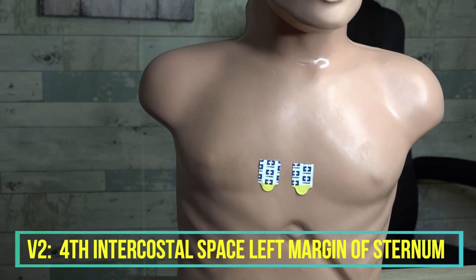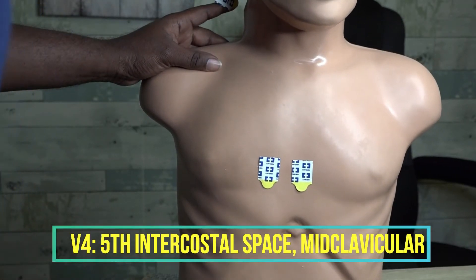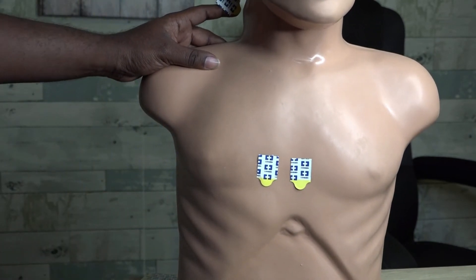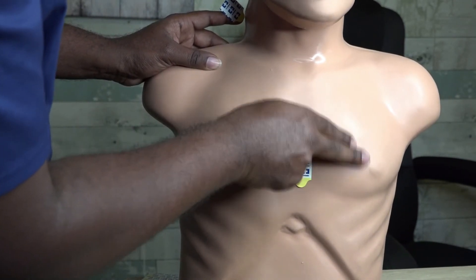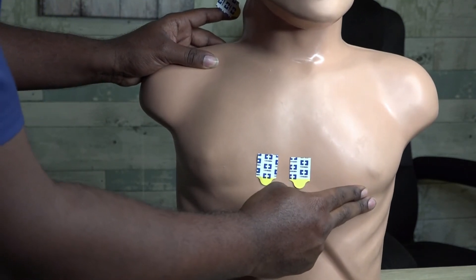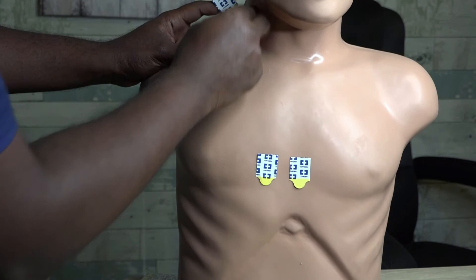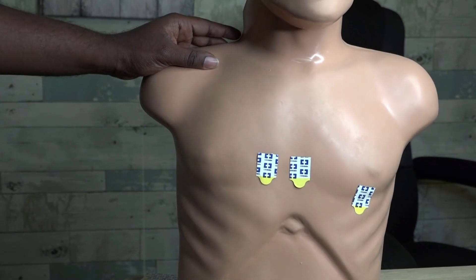Now I'm going to go to V4 before V3. V4 is located in the fifth intercostal space at the mid-clavicular line — an invisible line along the breastbone going right down where the nipple line is. Starting at the second intercostal space, count down: two, three, four, five. That fifth intercostal space right below the nipple is exactly where V4 goes. We place the sticker right under the nipple line.